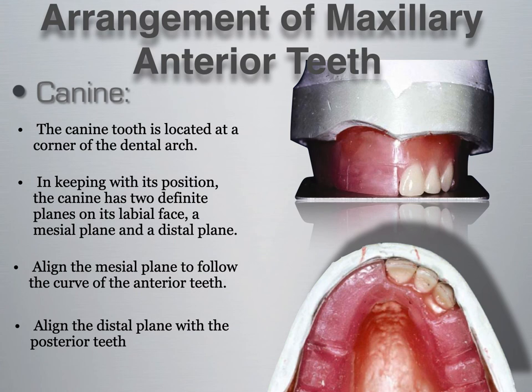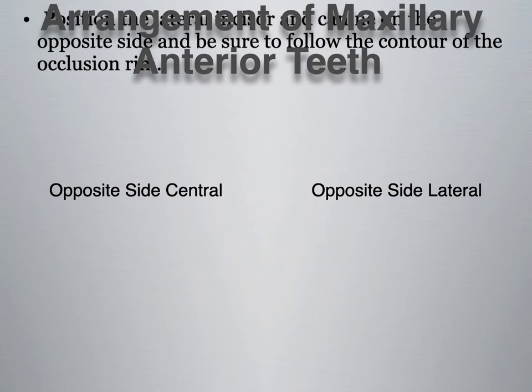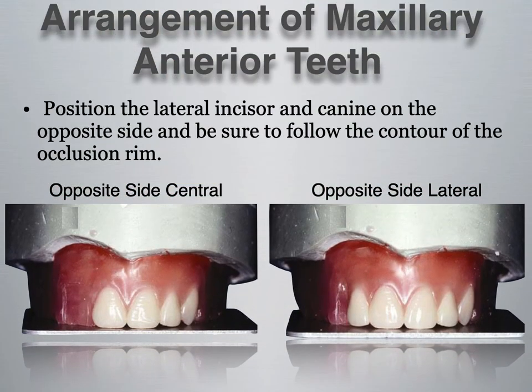If the turn at the canine doesn't happen, some patients do have wider smiles, but seeing the entire facial surface of the tooth may make the patient's teeth appear flared forward. So it is important to follow the arch form. The canine is known as the corner tooth of the mouth — it is the tooth that makes the turn toward the posterior teeth in the arch form. Once those three maxillary anterior teeth are set, the other three can then be set as mirror images following the same rules.